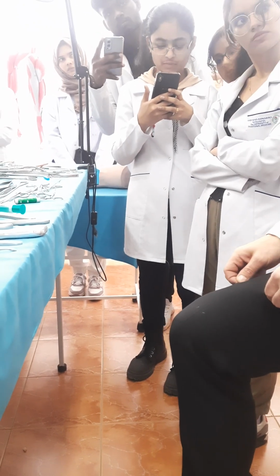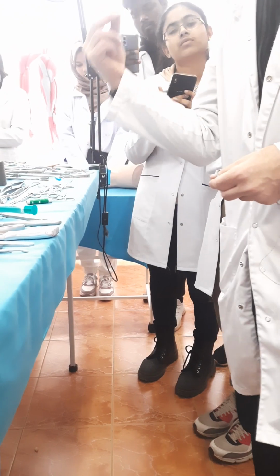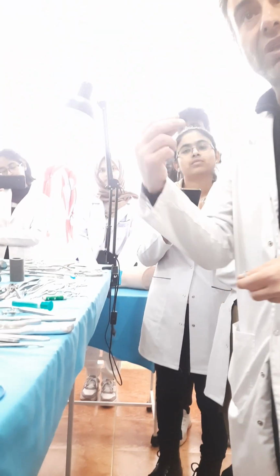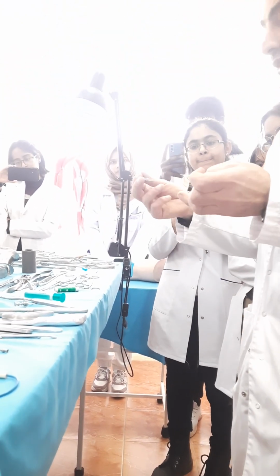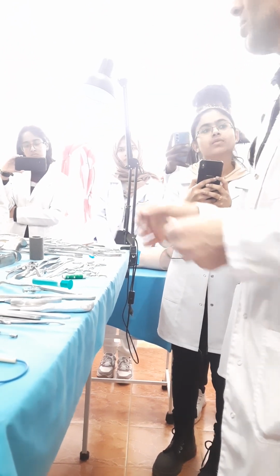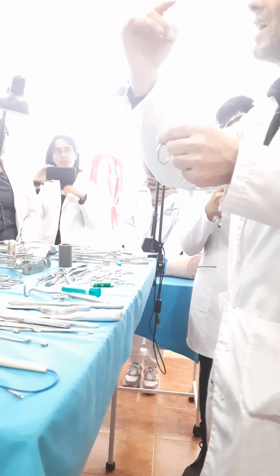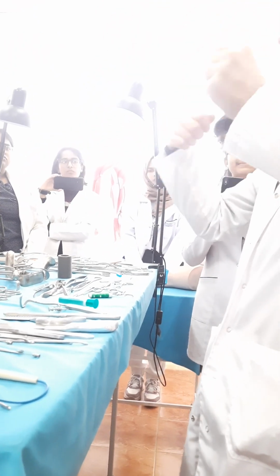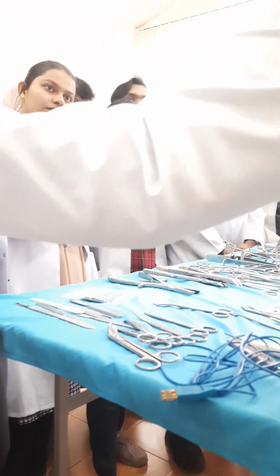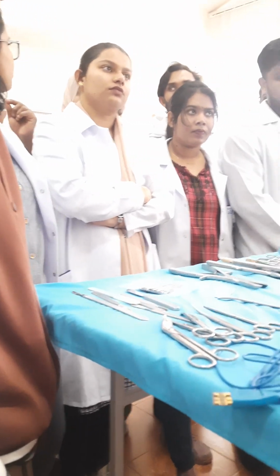I don't damage the periosteum, because after that I will suture it, so as not to damage the vessels and nerves. By the way, the Gigli wire saw we insert into the apertures by a special introducer. It is a metallic wire which has a blunt end and a very elastic body. When it touches the brain, it doesn't perforate it, it changes direction. So it works like a guiding wire.